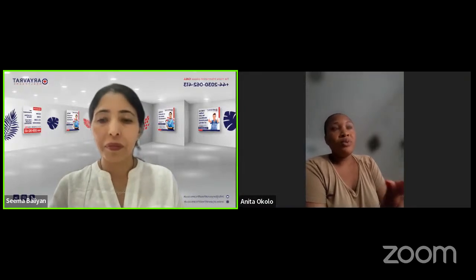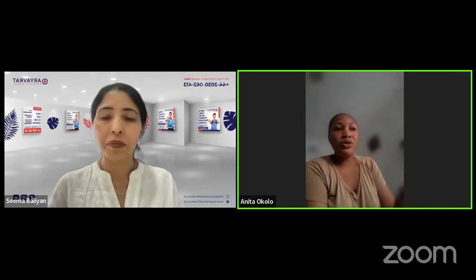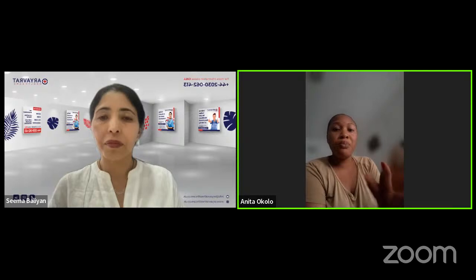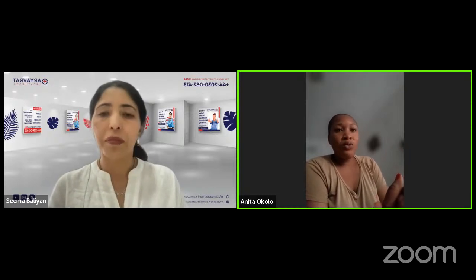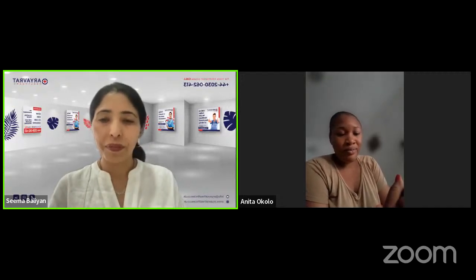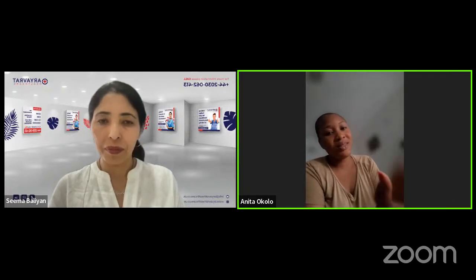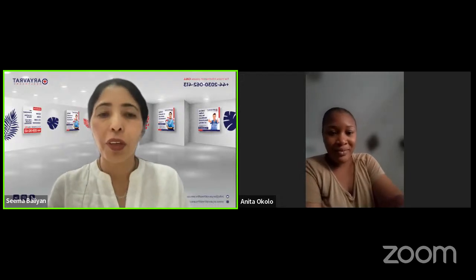Okay, I'm here to put you through a procedure, which is how to measure your peak flow rate and also the use of an inhaler. Would you mind if I proceed with that? No, that's fine. Okay, thank you. Now I have your consent, so I can proceed with that.